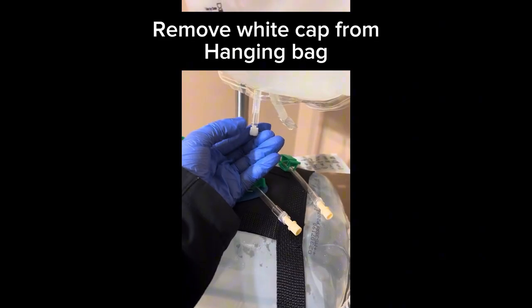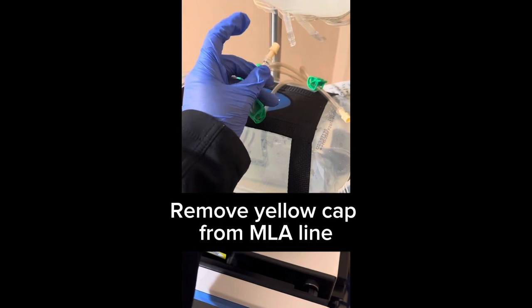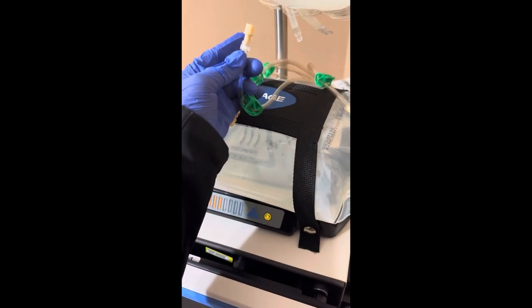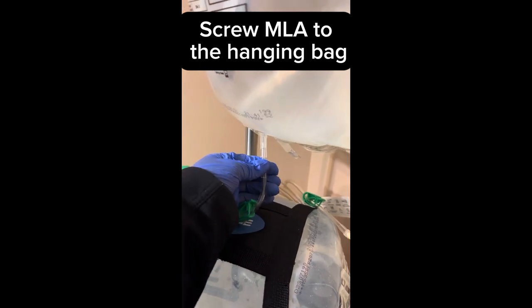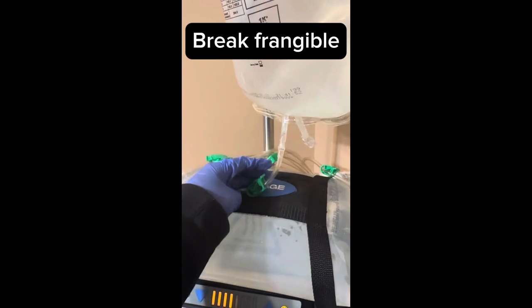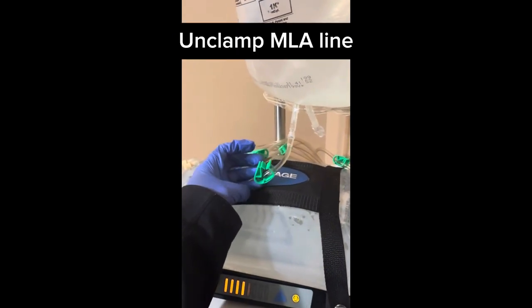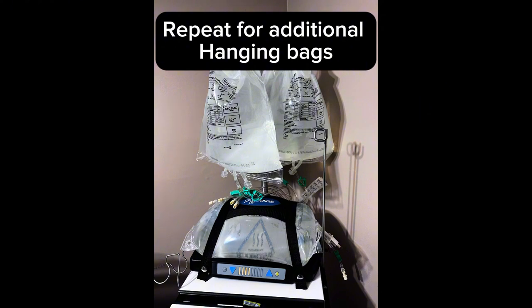Remove the white cap from the hanging bag, then remove the yellow cap from the MLA line. Screw the MLA to the hanging bag and break the frangible. Clamp the MLA line. Repeat for additional hanging bags.